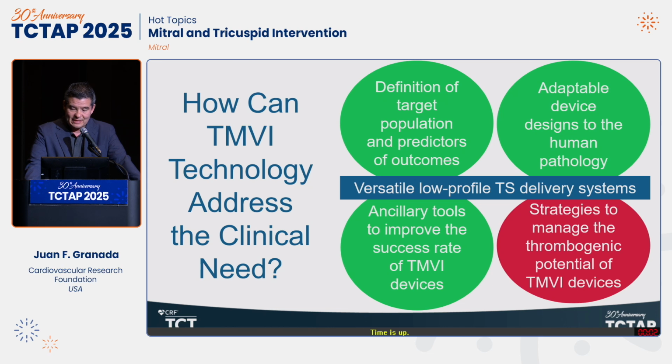And the last thing, which is not inconsequential and we need to pay very close attention to, is strategies to manage the thrombogenic potential of these devices, especially on the replacement side of things.